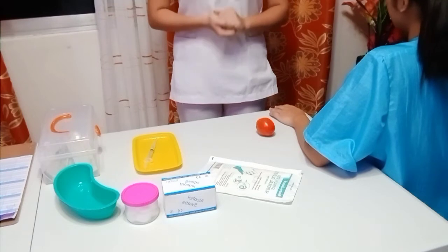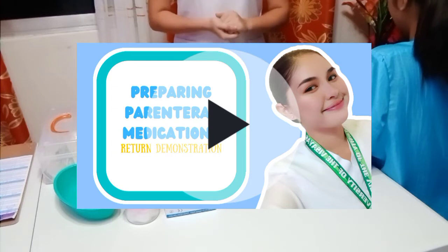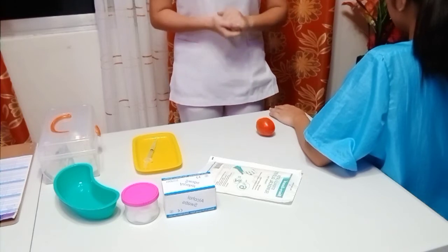Next is to prepare medication vial for drug withdrawal, which I did earlier on a separate return demonstration video. This is done to save time and effort and to carry out tasks in a systematic manner.